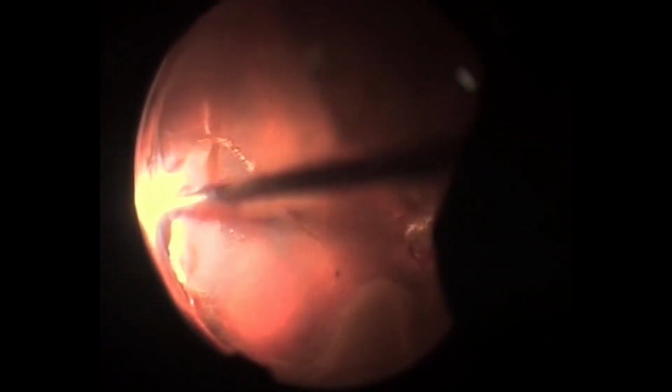As silicone oil and silicone buckle result in physical interaction and a strong bond is formed, oil does not come out freely, even with suction, and needs mechanical removal. After removal of oil, perfluorocarbon liquid was injected to flatten the retina.